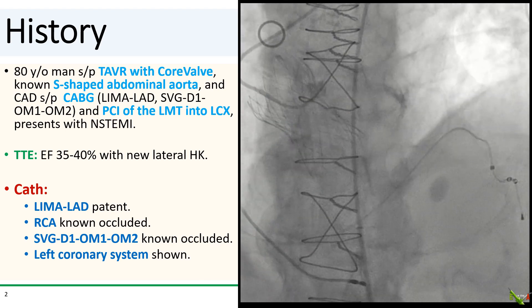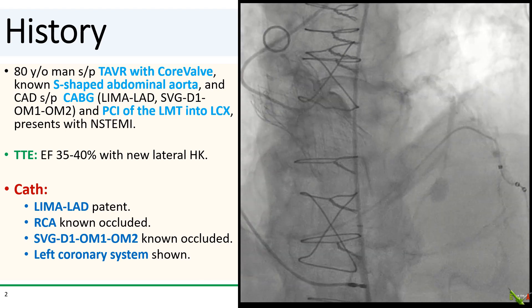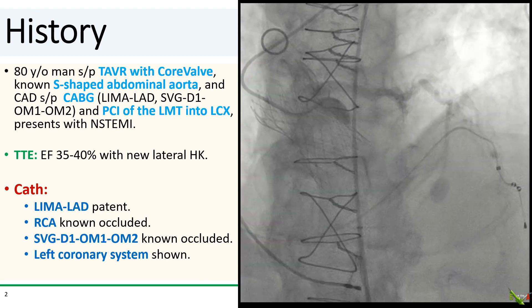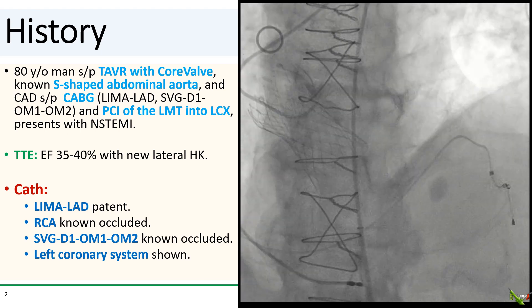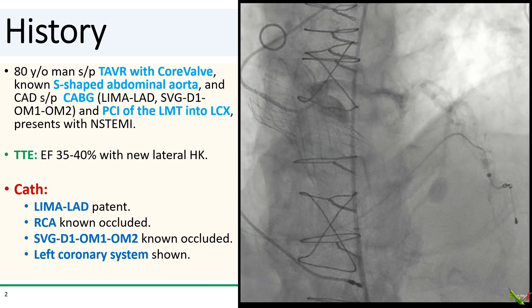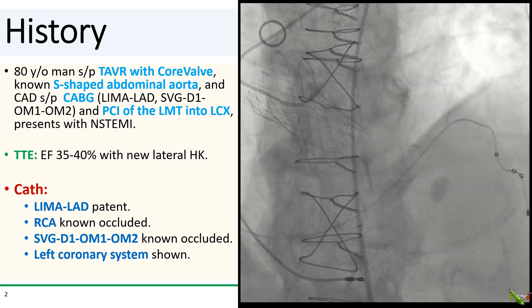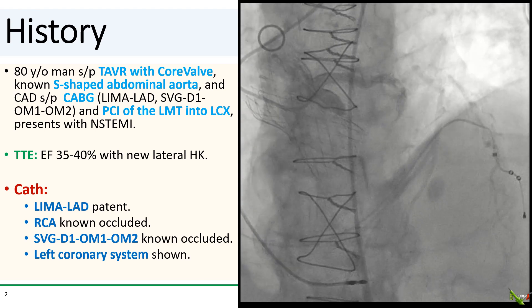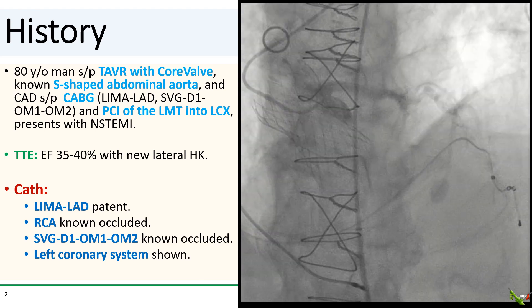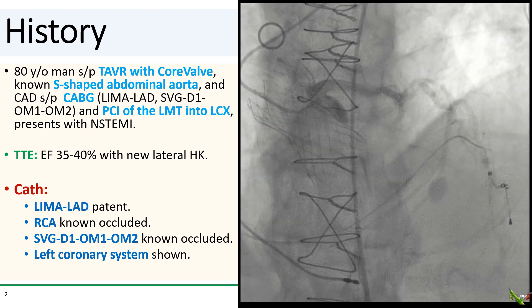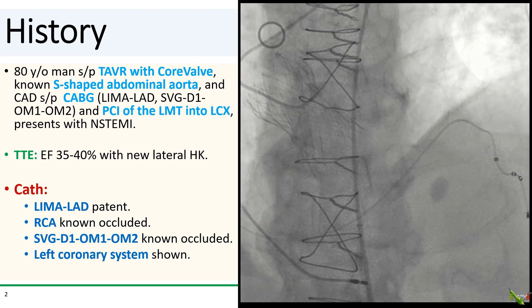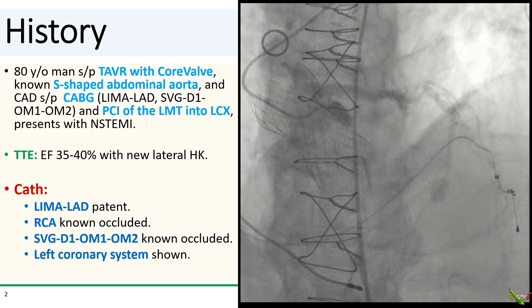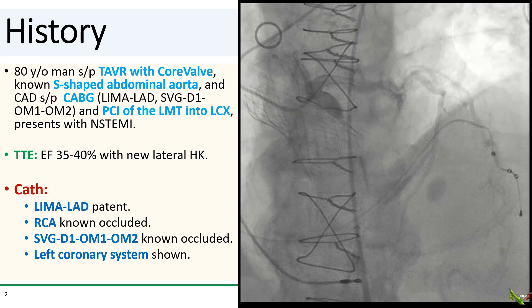Here you see the best image we got with a JL 3.5 catheter after a lot of manipulation. You can see that the left main is patent, but you don't really see much else. The opacification is really quite suboptimal.